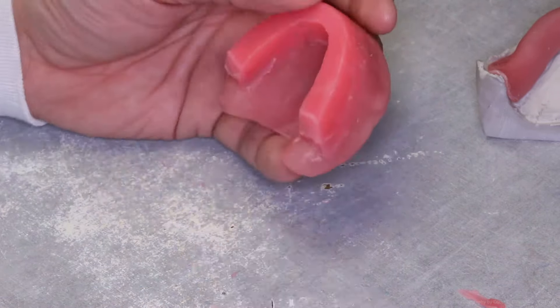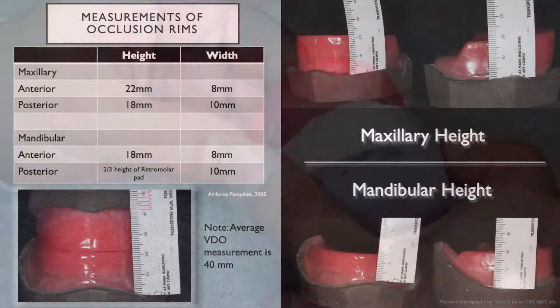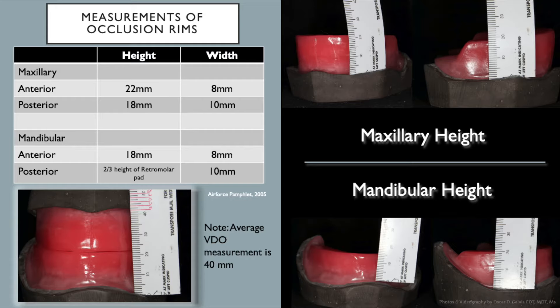A handheld butane torch aids in smoothing the occlusion rim as well as softening the wax to shape as desired. The technique for applying the occlusion rim to the record base for the mandibular arch is the same as the maxillary; however, they follow different measurements. The mandibular occlusion rim anterior should measure about 18 millimeters in height, while in the posterior there is no average — it should only reach two-thirds the height of the retromolar pad, which varies patient to patient. Widths are the same as maxillary: 10 millimeters posterior and 8 millimeters anterior.